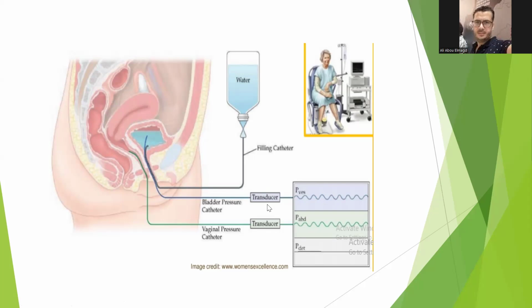After connecting these catheters while the patient is on the bed, we connect the urethral catheter to a water bag, which contains warm, sterile water.